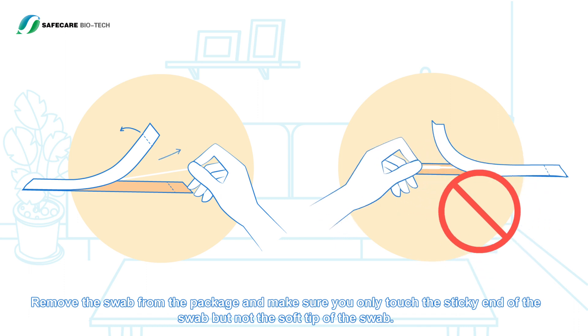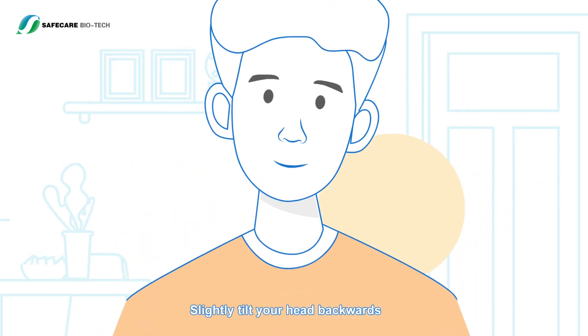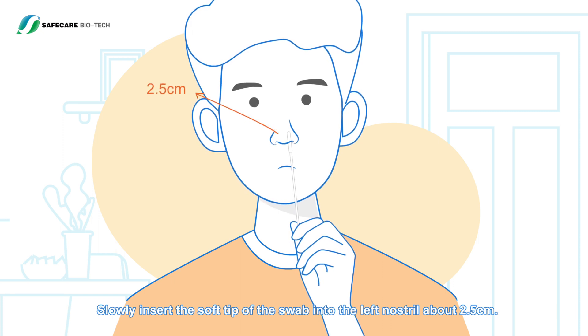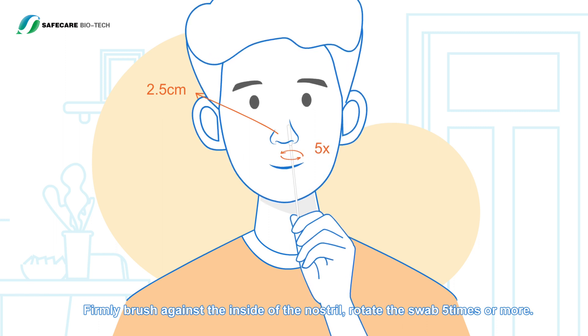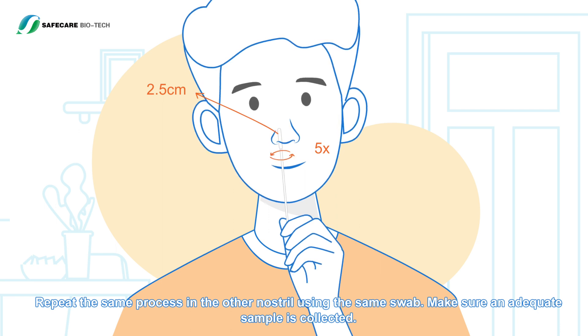Slightly tilt your head backwards. Slowly insert the soft tip of the swab into the left nostril about 2.5 centimeters. Firmly brush against the inside of the nostril and rotate the swab five times or more. Repeat the same process in the other nostril using the same swab, making sure an adequate sample is collected.